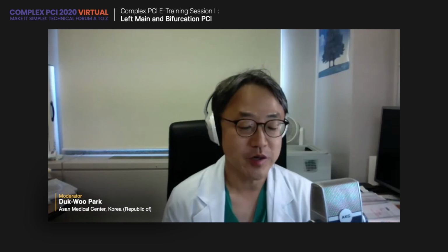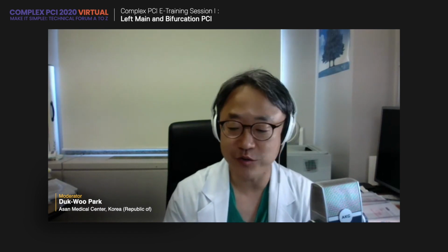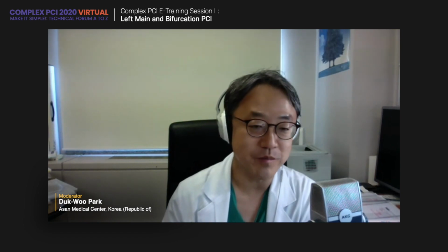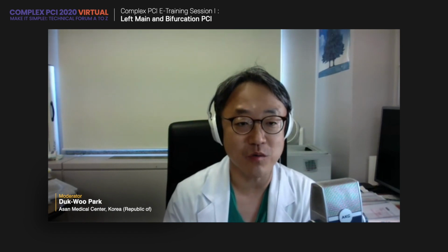I have one question to Dr. Shaoliang Chen. You are the real pioneer of DK crush, a global leader of complex two-stent technique. You introduced the DEFINITION criteria. In my concept, the anatomic SYNTAX score is used to decide PCI versus bypass surgery for left main or multivessel diseases, while the DEFINITION criteria can be used to decide one or two stents.